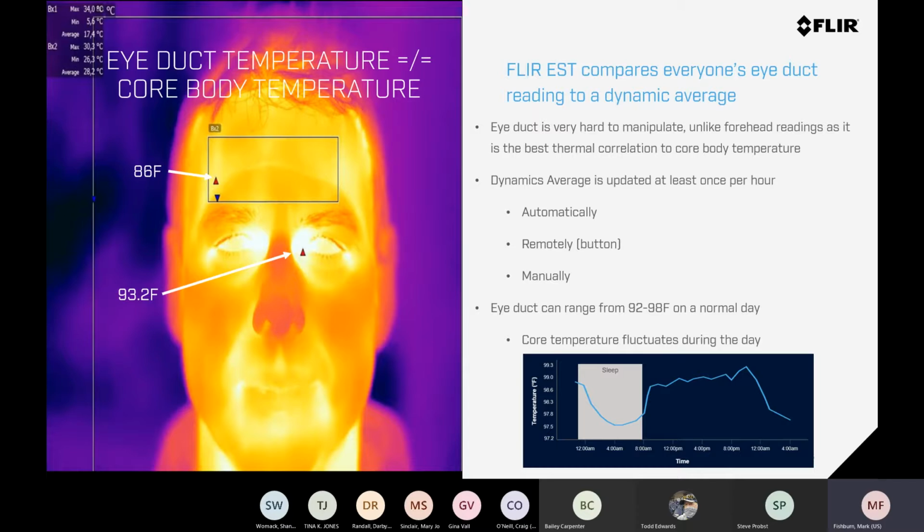I was pacing around in the sun on the phone, and when I walked in and they used the spot thermometer on me, I was very close to 100, like 99.5. And I said, there's no way. I said, I'm going to sit here in the cool for just a second and you can retake my temp. And it dropped precipitously in just a few minutes. So your outer skin temperature is going to be very different than your core temperature, and that's the reason why we use the tear duct, that inner canthus, to get that reading.